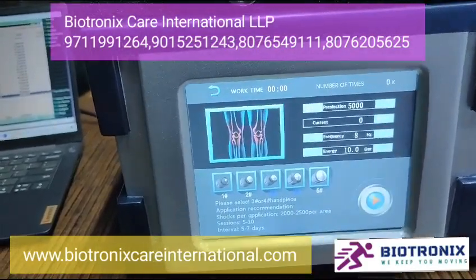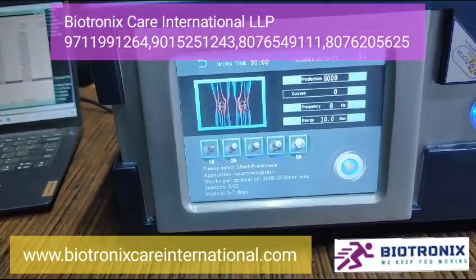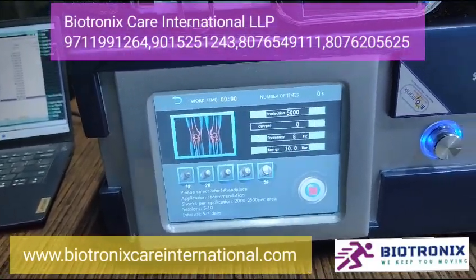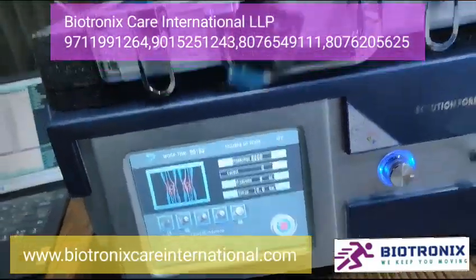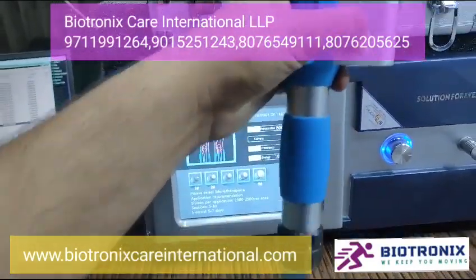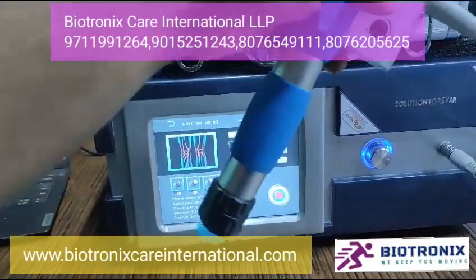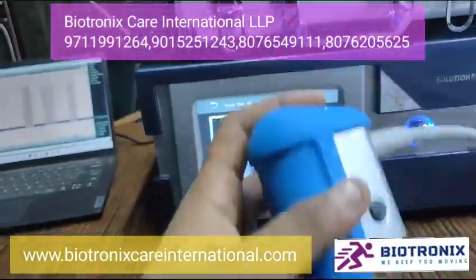Then you can press the pre-selection time and press the start button. Once you press the start button on the handle, it will start working. It's a very good machine.